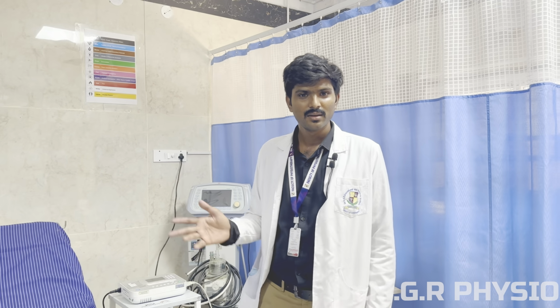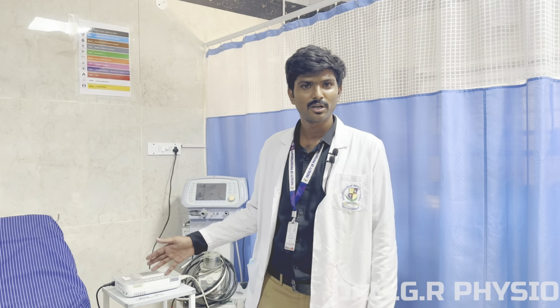any cardiac arrhythmias. So this machine is predominantly indicated for patients who are suspected of having heart diseases like myocardial infarction, or in critical care situations where the ECG is used to find out whether the patient has a shockable rhythm or a non-shockable rhythm, and in a few cases like valvular heart diseases, coronary heart diseases, etc. Now we can see the demonstration on the lead placement of the ECG.